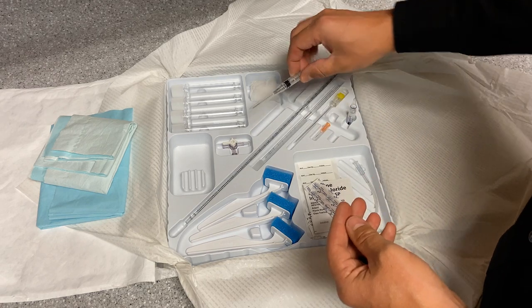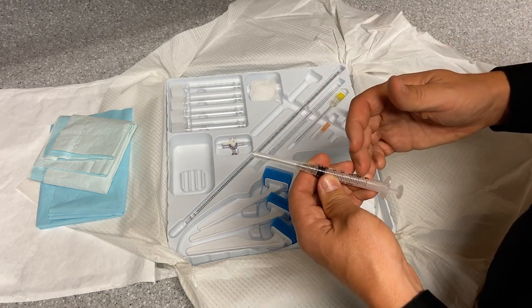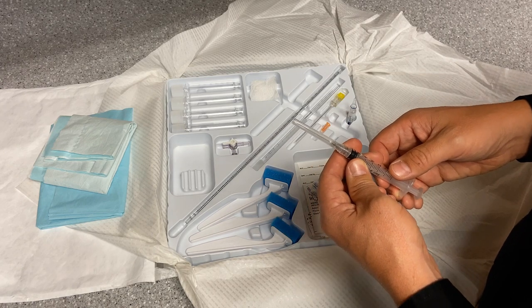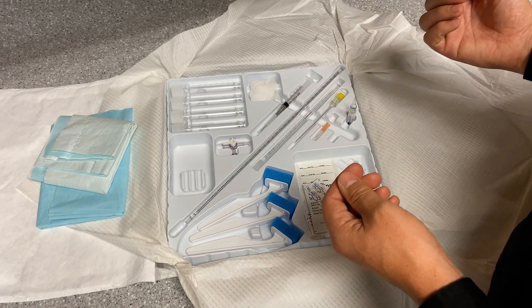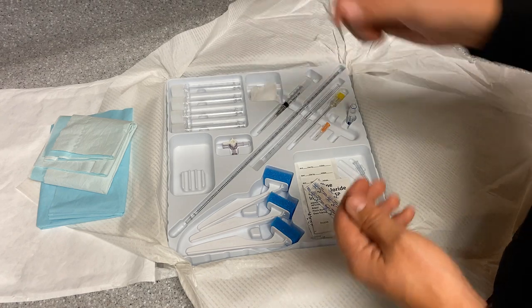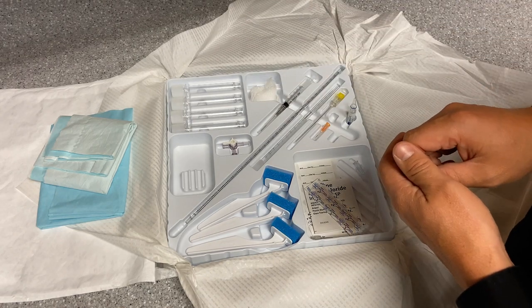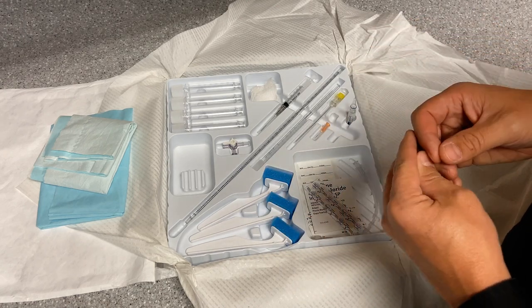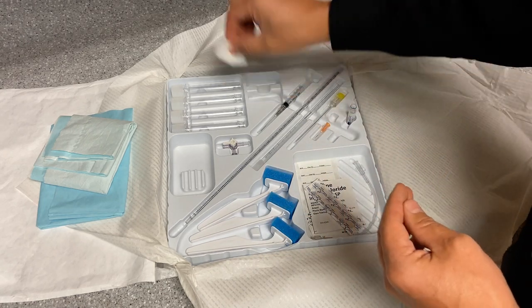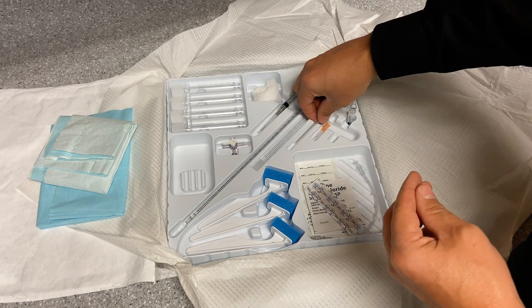Generally I inject about two to three cc's of lidocaine in the area, especially on an adult. There's also sterile gauze contained within the lumbar puncture tray. If there's any bleeding at the site after you've injected lidocaine, you can use that to clean up any blood before you use your spinal needle.